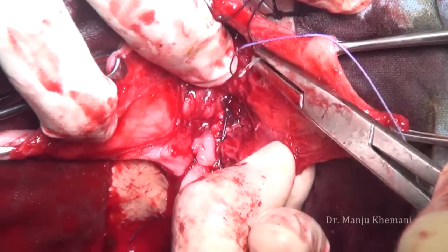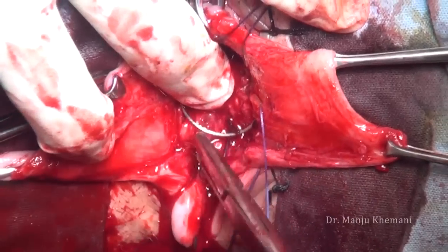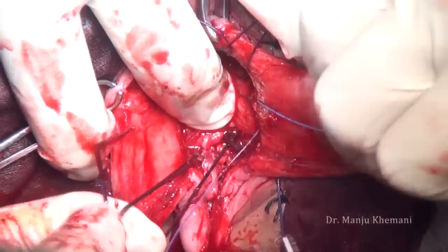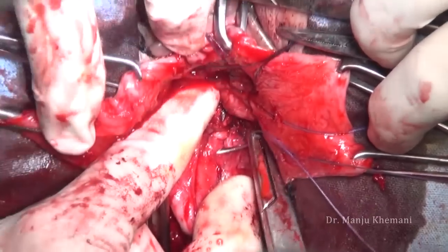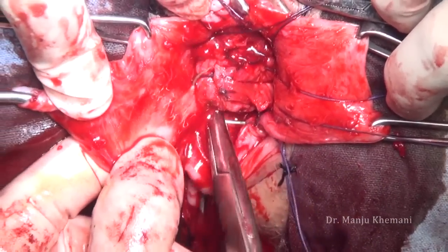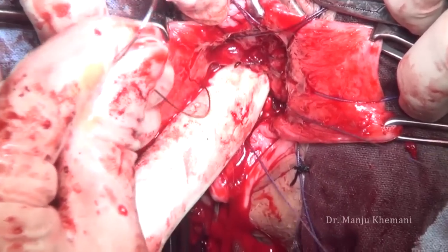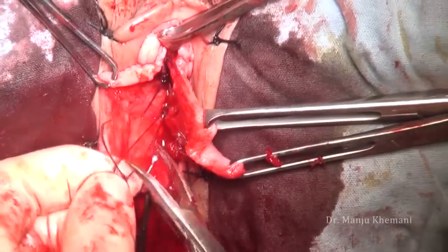This is the last suture here. Now since the bladder, uterus, and cervix are out, the bladder is hanging. Before tying the suture, take a bite on both uterosacral ligaments and on the posterior peritoneum so that the bladder base is not hanging. All these sutures are tied one after another.